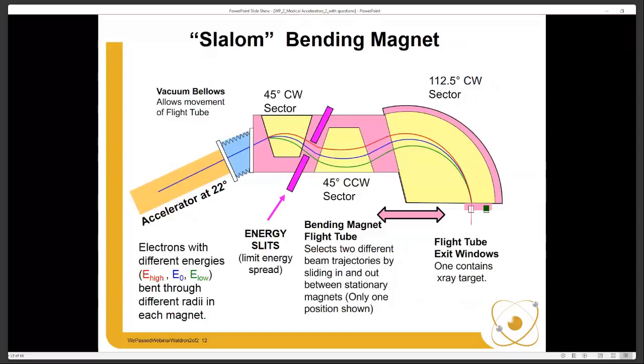We don't have to put all those bending magnets all in a 270-degree loop. We can take that same set of bends and rearrange them. So we bend first down and then up and then down again. If we consider that the Elekta design, the accelerator is already sitting at some angle, and we combine the bends of the angles, we still come up with a number that is 220-something degrees.